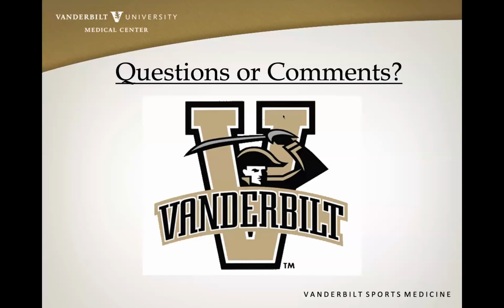And then I've also struggled, and I thought yours was interesting, with the dynamic scan sometimes, and feeling like I'm staying really nicely localized over the same bony cortices when I'm looking for that dynamic instability. And I've gone back and forth between gripping and trying ulnar and radial deviation.